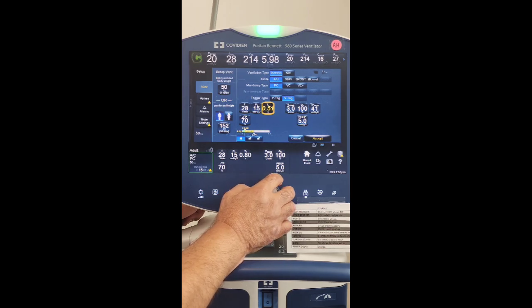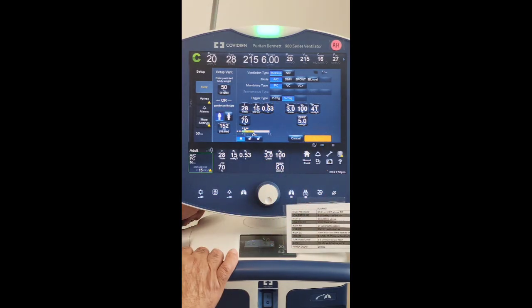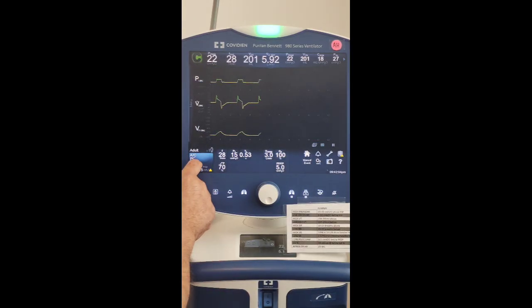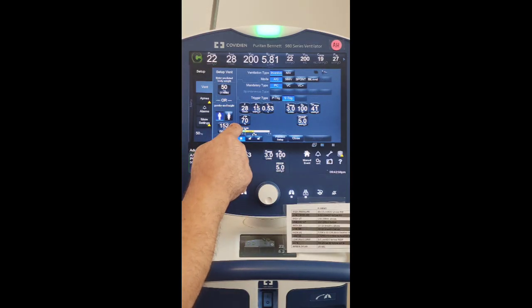Okay, we have 0.5. Let me go back up. There we go, 3.04, 0.53 seconds. Okay, we were able to accept that. So the I time now, and it'll show you in here, is 0.53 seconds.